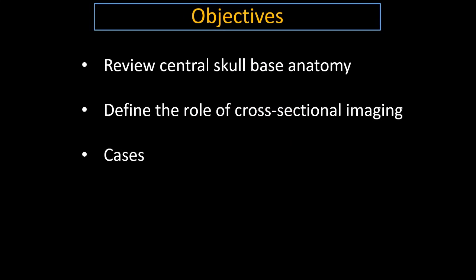In the next 30 minutes, we will review the central skull base anatomy and define the importance of CT and MRI in assessing central skull base lesions, and do a case-based review of lesions centered within the skull base.